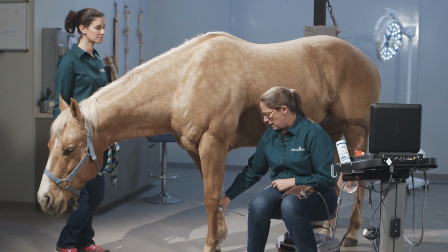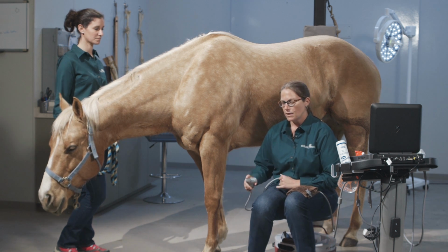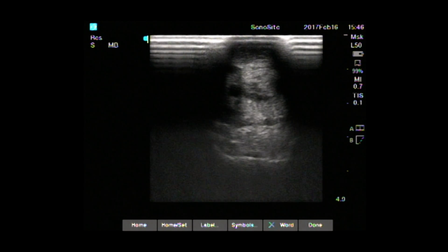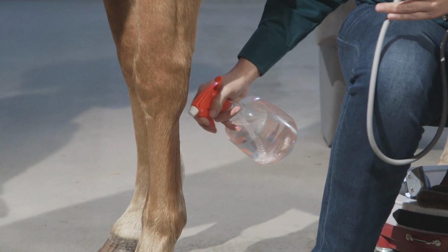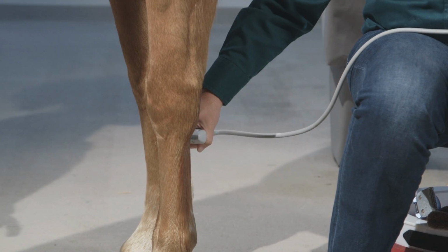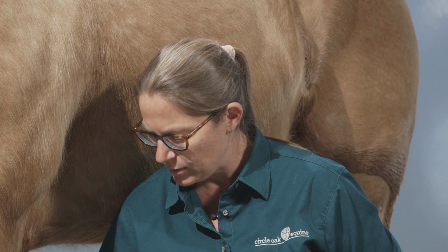So then we'll go ahead and start our scan with just the gel on. Oftentimes I'm scanning without a standoff when I'm scanning an unclipped leg. I find you get a much better image in that situation. I will also label the unclipped situation so that we know that I was scanning the images unclipped for their record. I'll just go ahead and spray some alcohol onto the area and see if that improves my image at all. I find if I have good preparation, I don't use a standoff in the lower legs, and I have a good quality machine, I can often get by with very little difference in my gain than I would need in a clipped situation. And then I would go ahead and scan the leg.